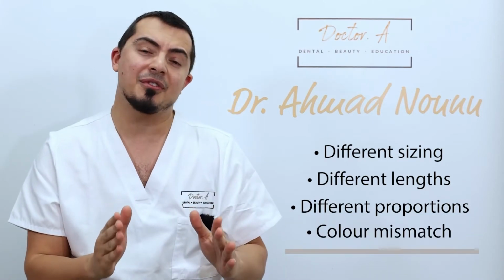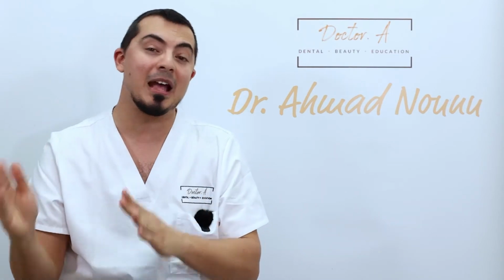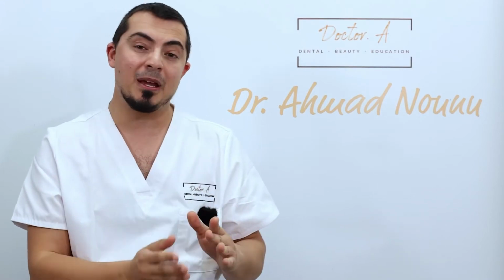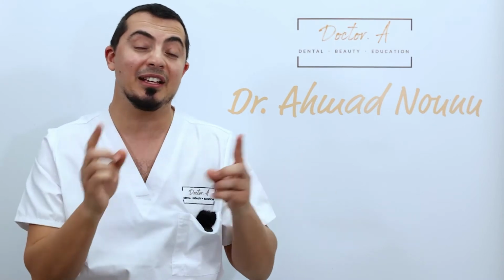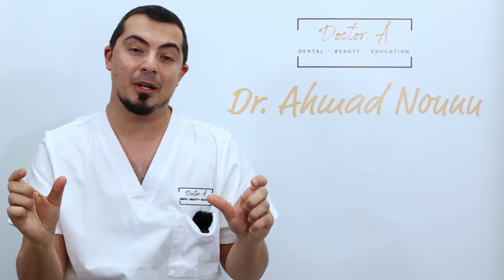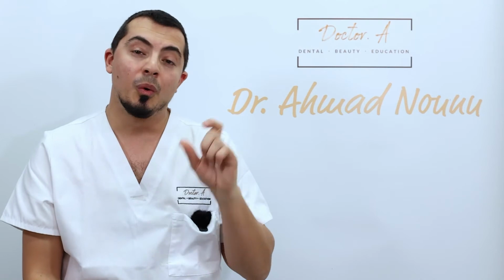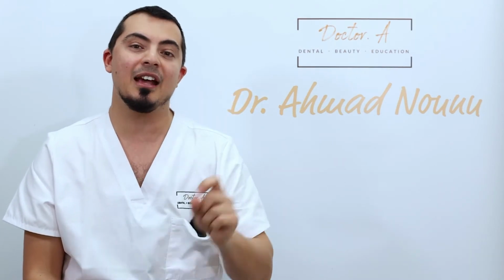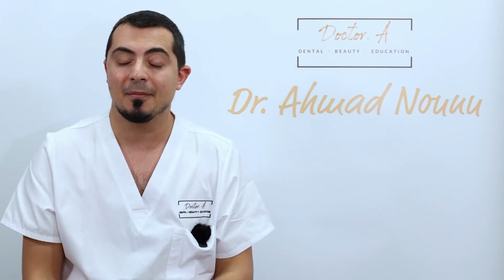But the other big factor is that even though it looks like the size of this particular area, it doesn't match the other side. This all comes down to using the technician's skill and experience to get the line angles on the different areas absolutely right, so that it can trick the eyes into making it look like the 2 teeth are very similar proportions, even though they might not be in certain circumstances. Also, the colour match is imperative, because it's so important to get that right, again, for the eyes not to look at that and think there's something slightly odd with the 2 teeth.